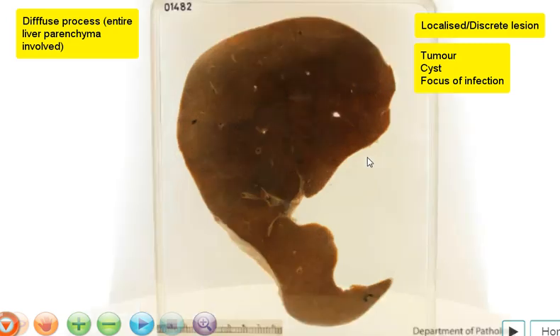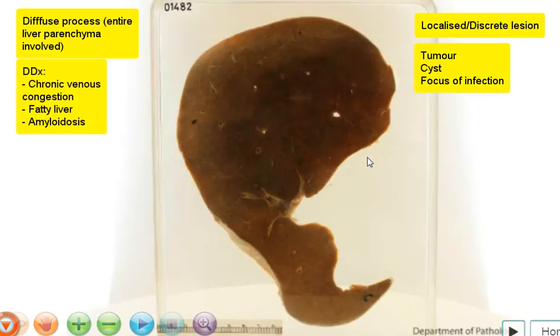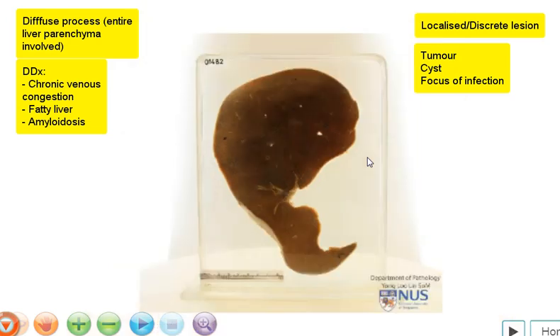In diffuse conditions of the liver, some common examples would include chronic venous congestion, fatty liver, and this condition, which is not as common — and this is an example of amyloidosis involving the liver.